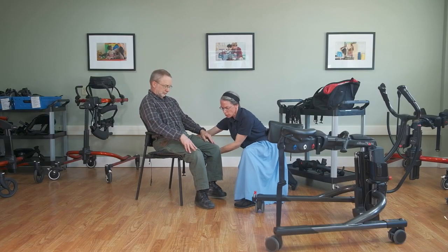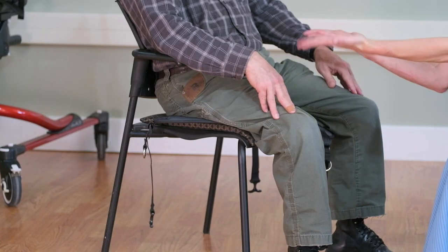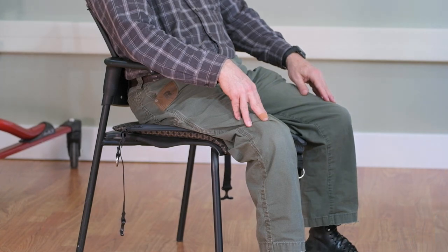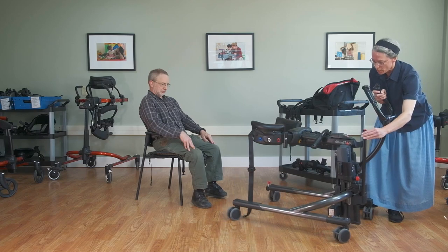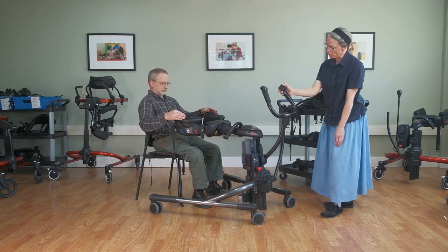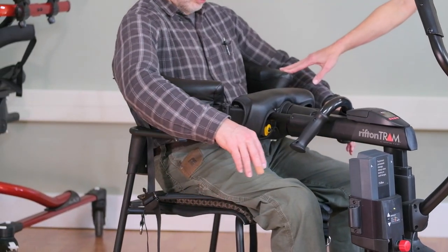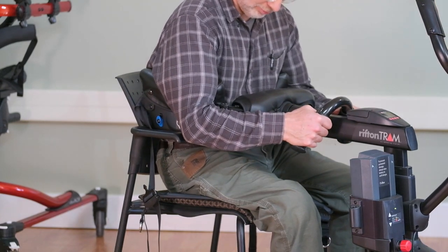The thigh strap is what performs the lift, so we don't want it too far back — they may tend to slide forward — and we also don't want it too far forward — they may tend to slide down and back out. Here we have the bar that allows us to spread the base legs, and here is the up-and-down switch on the caregiver handle. We want the body support system as low and snug as possible around the student's trunk.